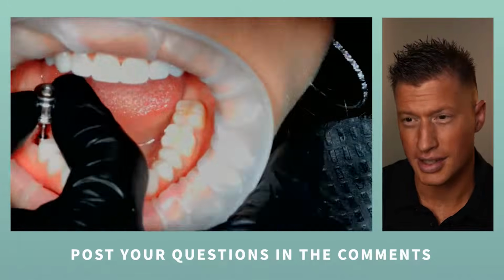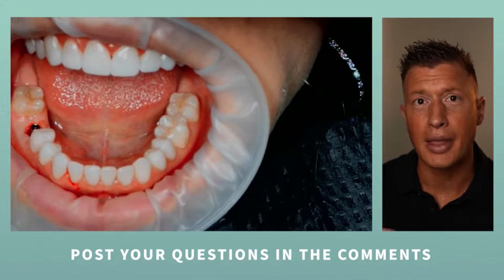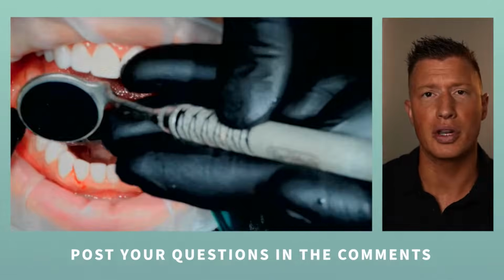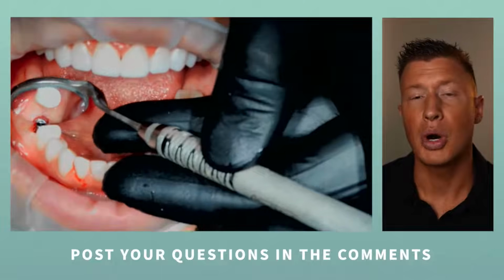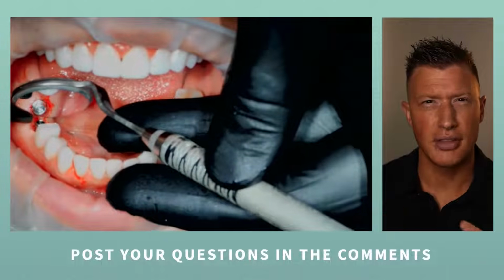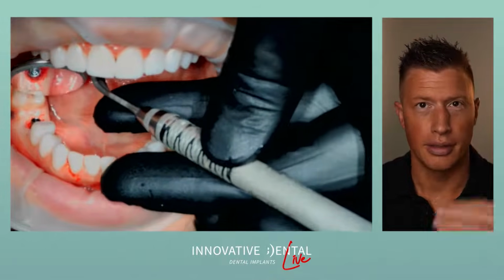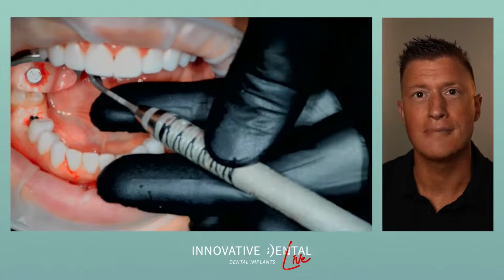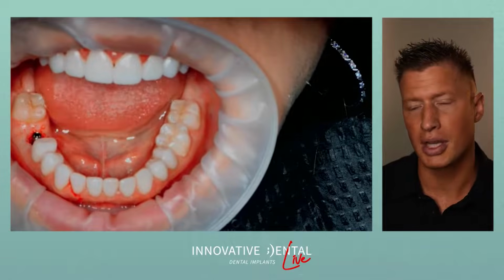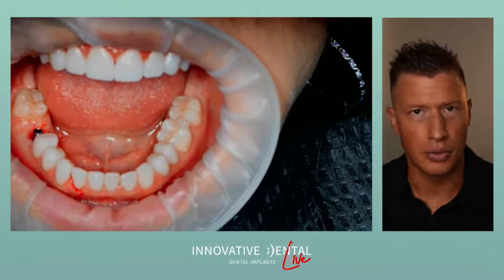Obviously with a dental implant, we're going to be waiting until this site is fully healed. That's where the bone's going to lock into the implant. We call that osseointegration, but it basically just means the implant now is locked. The bone has become one with the implant. Bone connects to implants differently than it does your teeth. With your teeth, it's going to use some ligaments. That's why teeth, if you push on them, we can move them with braces, with Invisalign. Whereas with an implant, we're not going to be moving it. Once it's locked in bone, the bone becomes one and attaches itself to the implant. There is no ligament in between the bone and your implant.